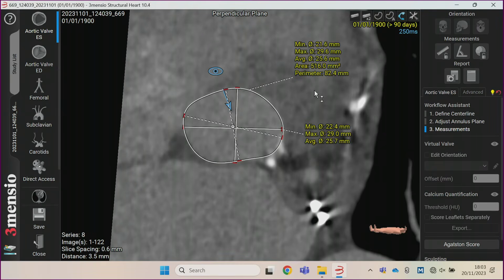But if you're at 34, then it's less important. You're implanting a calcified bicuspid, you go to 1 to 0, and I agree with you, that's what I would do. But there is a bit of concern by many that with this kind of valve, you might have to post-dilate, and if you're at 0 with that degree of calcium, you might embolize. So that's something to consider.